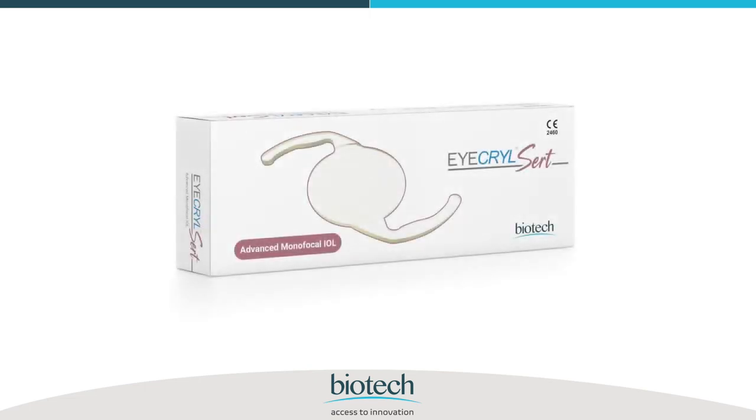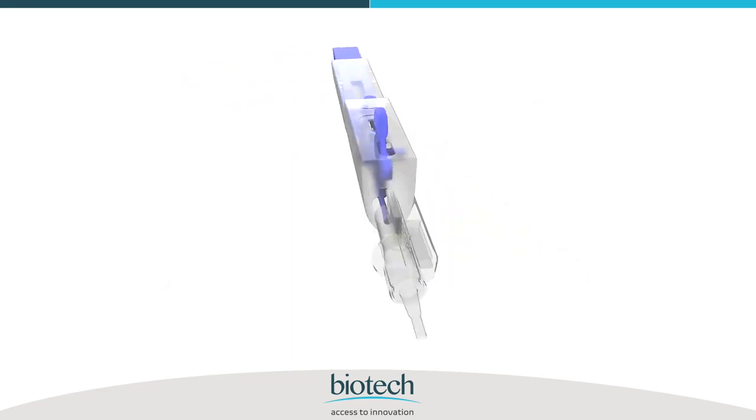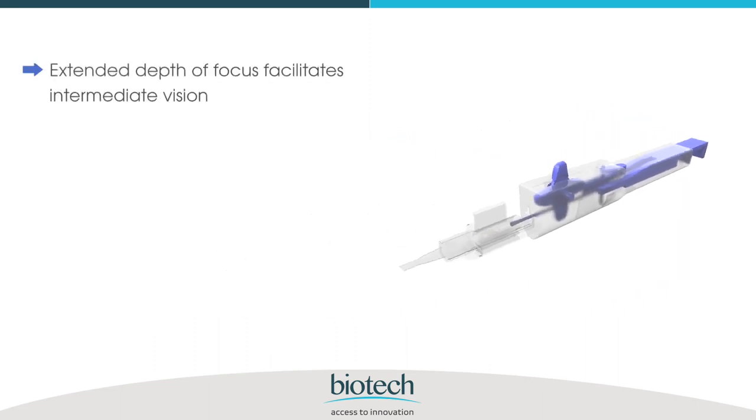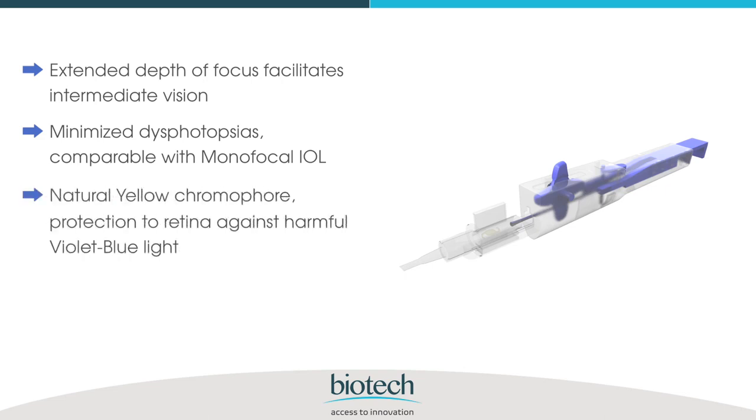Eyecryl Sert, inspired by natural vision, is an advanced monofocal hydrophobic IOL with extended depth of focus. It facilitates intermediate vision, minimizes dysphotopsias comparable with monofocal IOL, and features a natural yellow chromophore to provide protection to the retina against harmful violet-blue light.